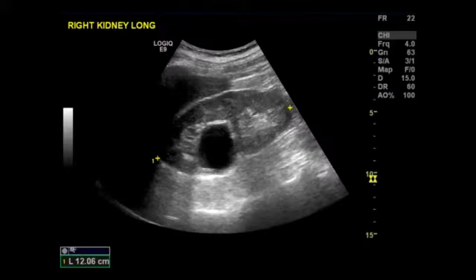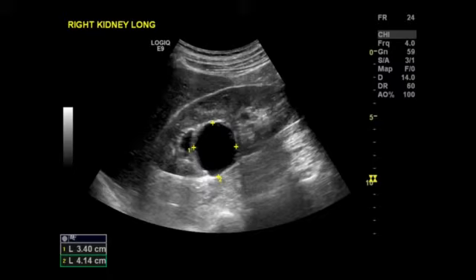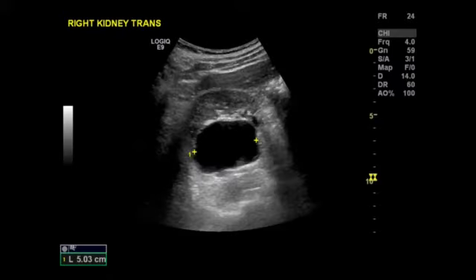And here's an example of a simple parapelvic cyst. It's rounded, it's got no real discernible wall, it's anechoic, there are no nodules, there's no flow within it. That's a simple parapelvic cyst. They're often more than one together, and here there's a small one and a second parapelvic cyst there, and here it is in transverse section.